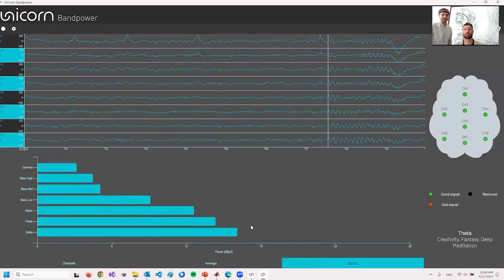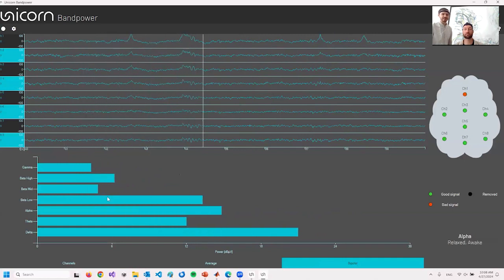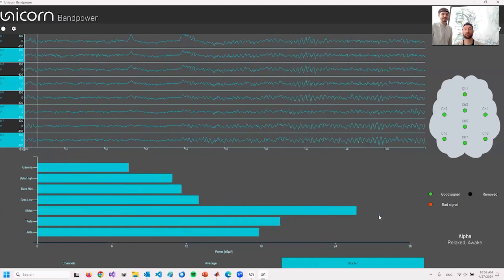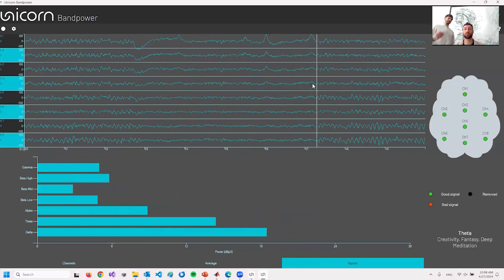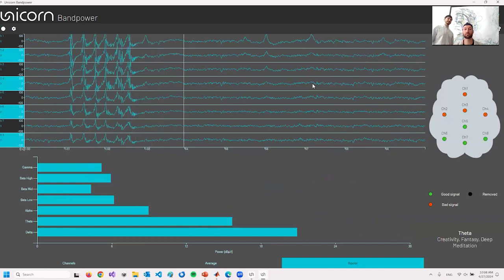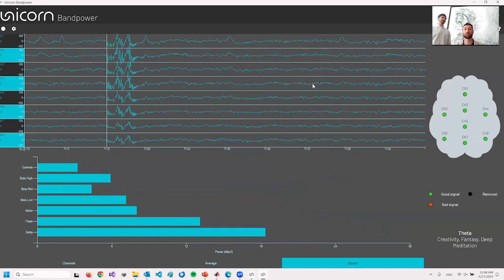We can also check the average. So right now we have no alpha. So Leo, can you close your eyes? And we can see alpha band is rising and becoming the most present frequency band. And that's what you can do with the band power application. You could also go to sleep and check if theta and delta waves are rising. You could do some math tests and check if the beta and gamma bands are rising. So band power is a feature that a lot of neurofeedback tools are using.